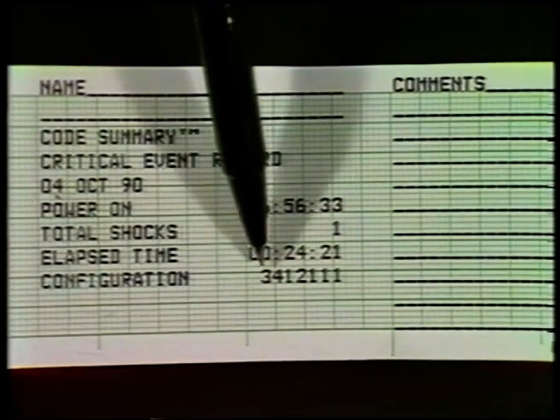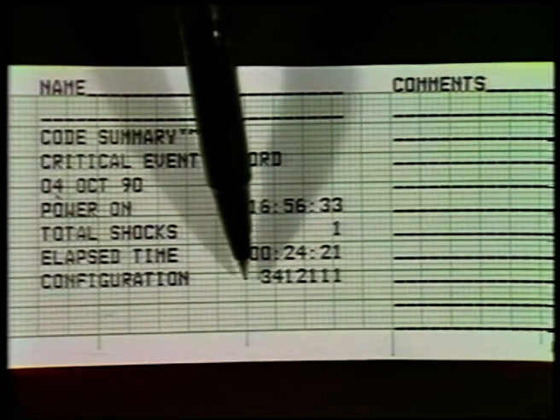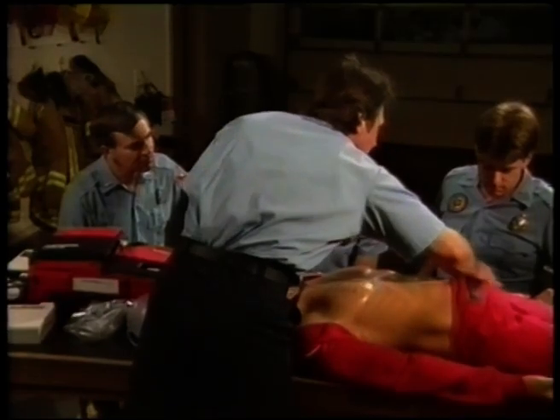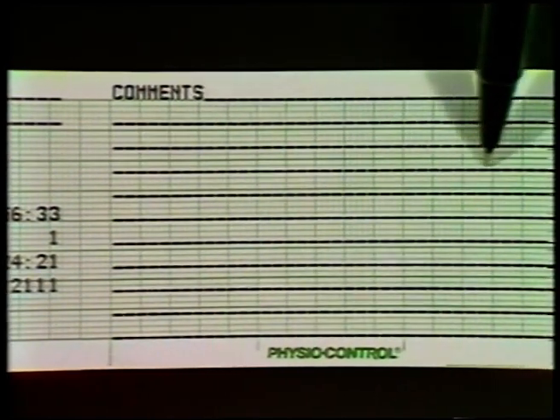The configuration number is a 7-digit number which represents the LIFEPAK 300's configuration at the time Code Summary was printed. The LIFEPAK 300 can be configured with several different options, and this number reflects which options were available. The operating instructions contains a key which explains what a particular number means. Lastly, there is a unique identification number, not shown here, that tells you which LIFEPAK 300 produced the summary record. To the right of all this information is an area for your handwritten comments.